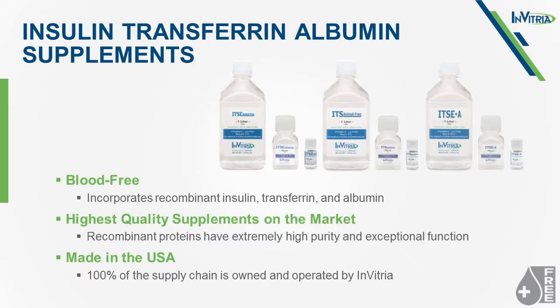Insulin is typically found between about 50 and 80 picomole per liter. Albumin is in the neighborhood of 35 to 50 grams per liter, and transferrin is between about 1.5 and 4 grams per liter. So if serum is reduced to, say, 50% of the original concentration, the major components can be held constant by the inclusion of recombinant versions.